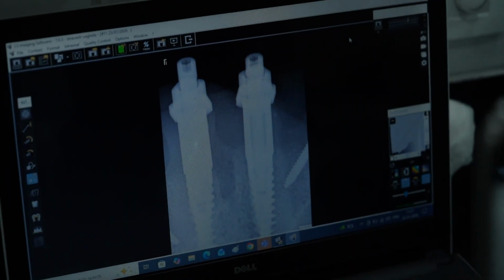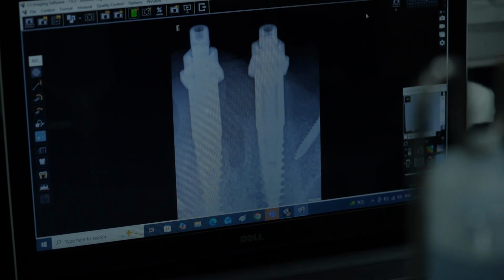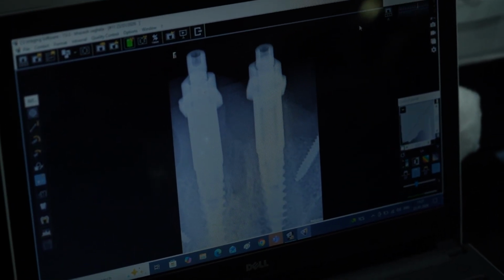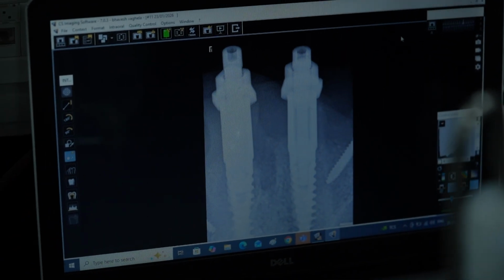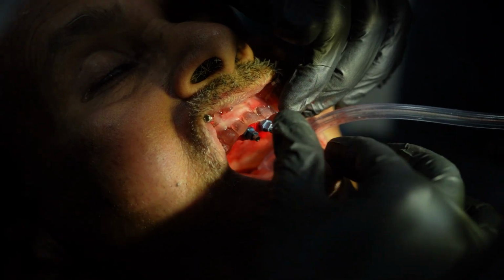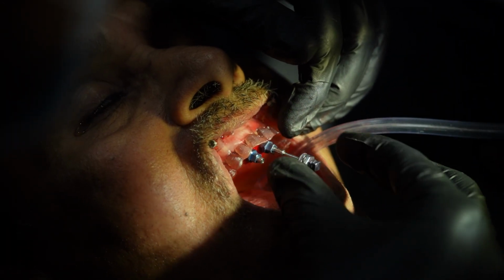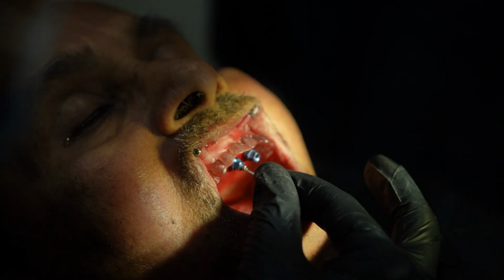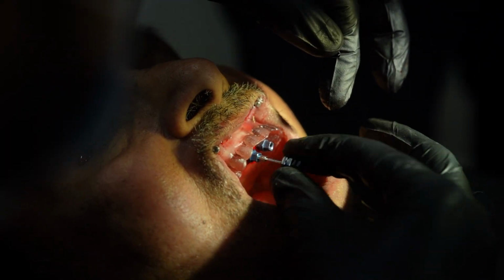So this is in post-op X-ray. You can see the parallelism. These side pins are the stabilizing pins which we have kept. Now you can see the bone level and the implant level. This is as per what we planned. And now you can see how we are supposed to remove this thing. This is a driver and we are just going to unscrew it. Similarly over here, we will just unscrew it.